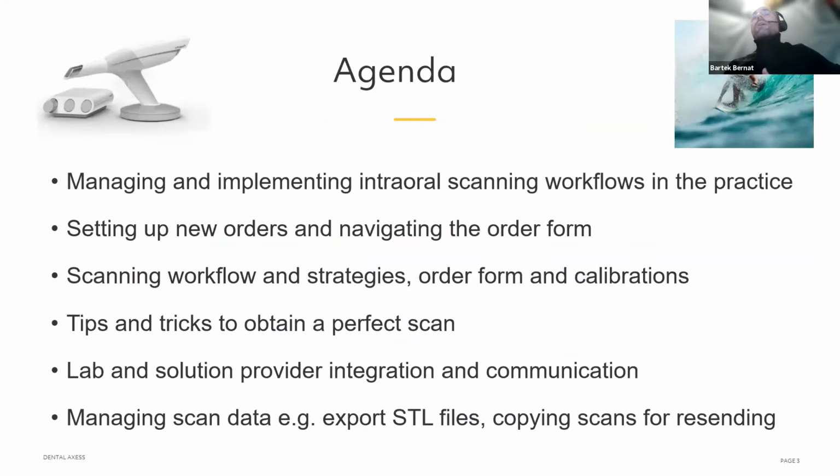Okay, so those are the subjects I would like to cover with you. The plan is, I'm going to show you some information here on the slides. I'm also going to switch sometimes to the TRIOS application and show you things around, because I believe you'd like to get as much information as you can about the TRIOS system, how to get started with it, how to implement it in your practice. Possibly you already have your system there and you're just looking for a good start.